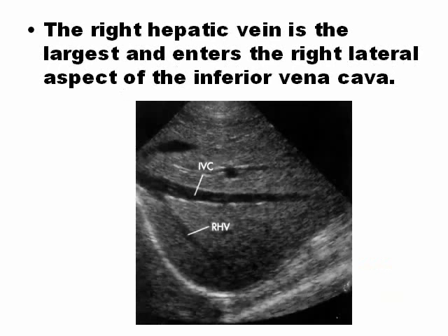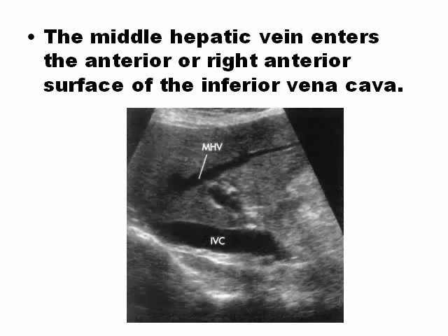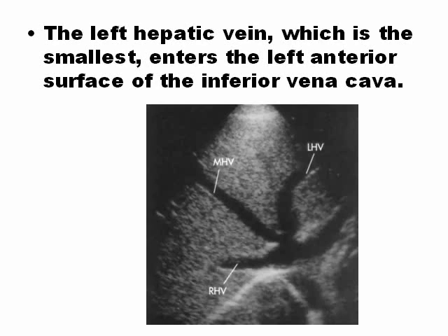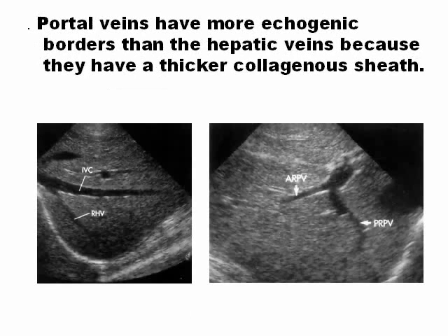The right hepatic vein is the largest and enters the right lateral aspect of the inferior vena cava. The middle hepatic vein is anterior, and the left hepatic vein is the smallest one, entering the left side of the inferior vena cava. Portal veins have more echogenic borders than hepatic veins — you can differentiate them because hepatic veins do not have echogenic walls.